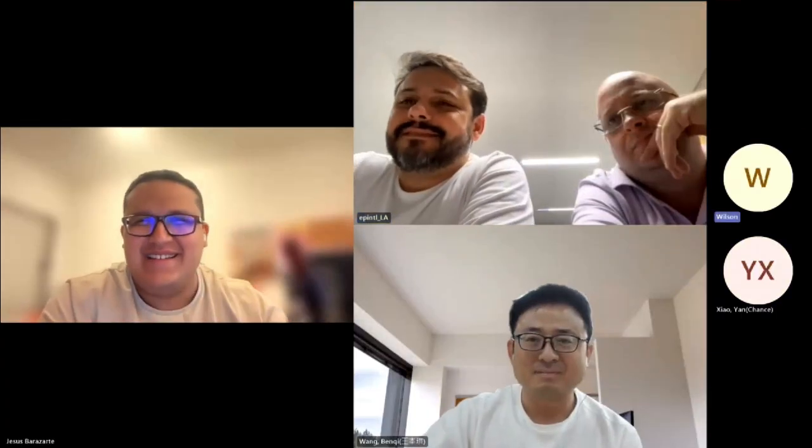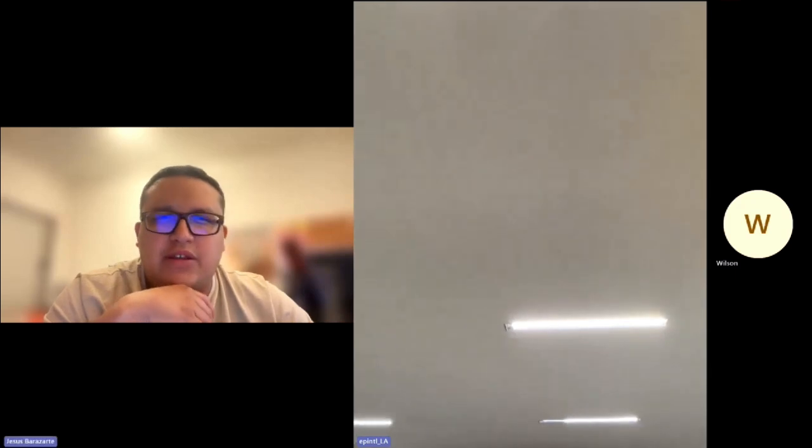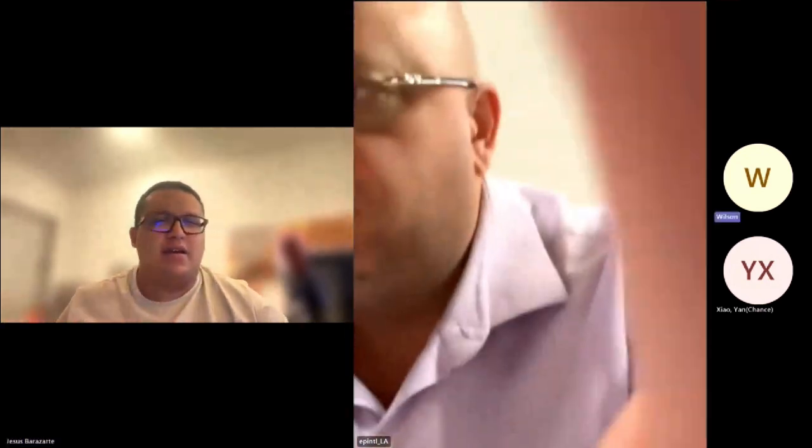Now we can talk about the upgrading, and I will invite the engineer to come here. You already connected your 3D system to the internet, right? Let me ask you something. Do you want us to install Microsoft Teams in that system, in the Columbus system? We will help you to upgrade the system.